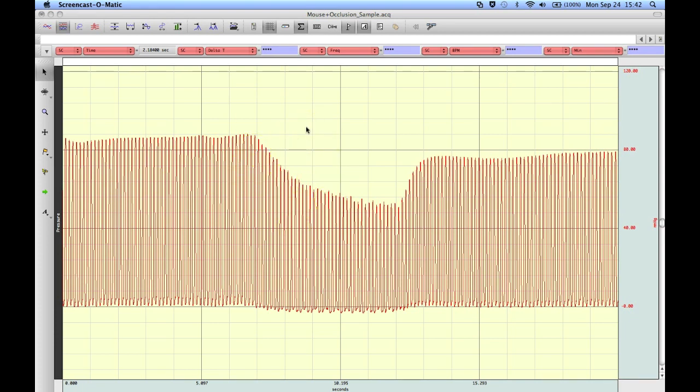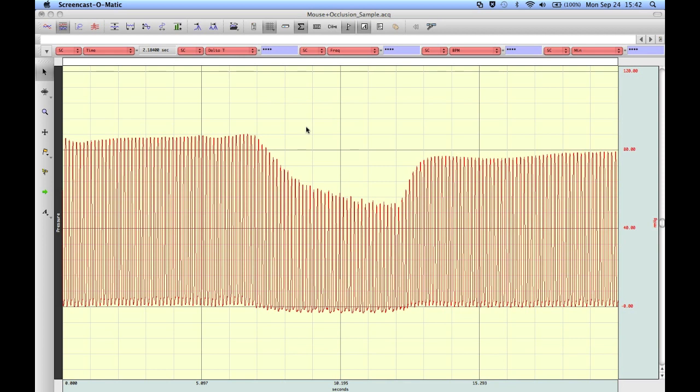The routine will then score the data and either create new channels based on the measurements that were taken from the data, or paste the values into the journal file or into an Excel file for further analysis.